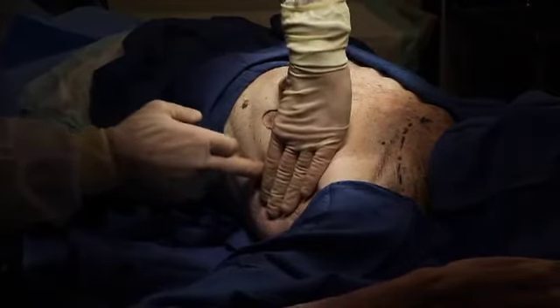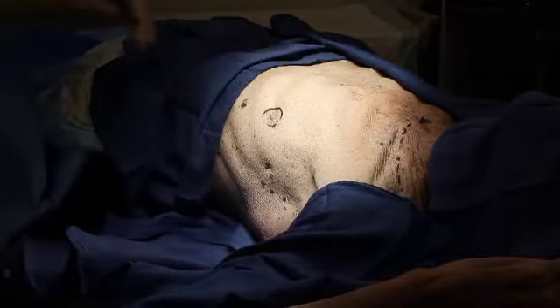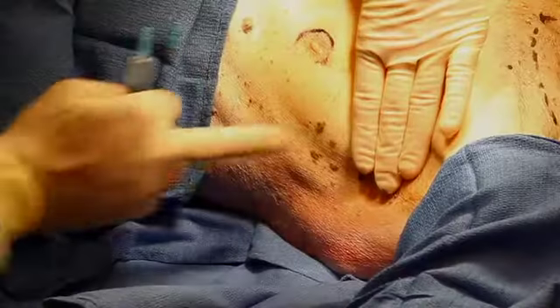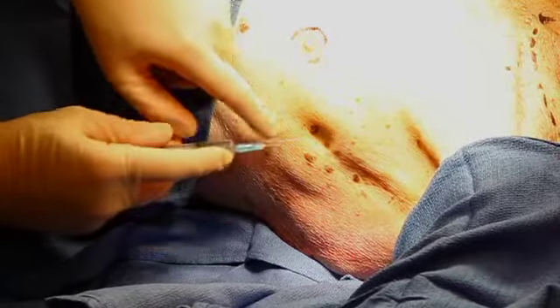If the patient's condition allows, take time to position the patient's arm above the head, don a sterile gown and gloves, surgically prepare and drape the patient's chest, and locally anesthetize the skin and periosteum at the insertion site.